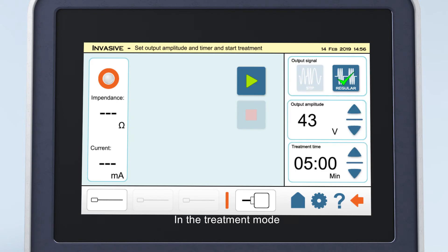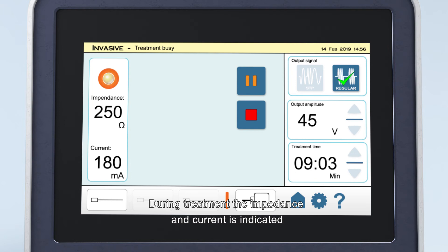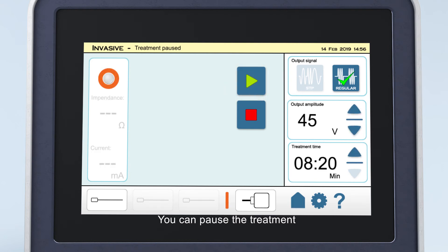In the treatment mode, you can choose between the output amplitude and treatment time. During treatment, the impedance and current is indicated. You can pause the treatment, after which the treatment can be continued.